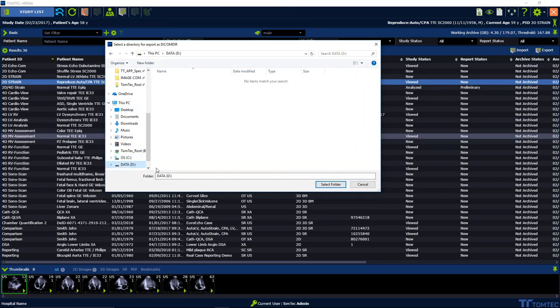A save dialog will open up. Change the storage location and fill in the name, then save.